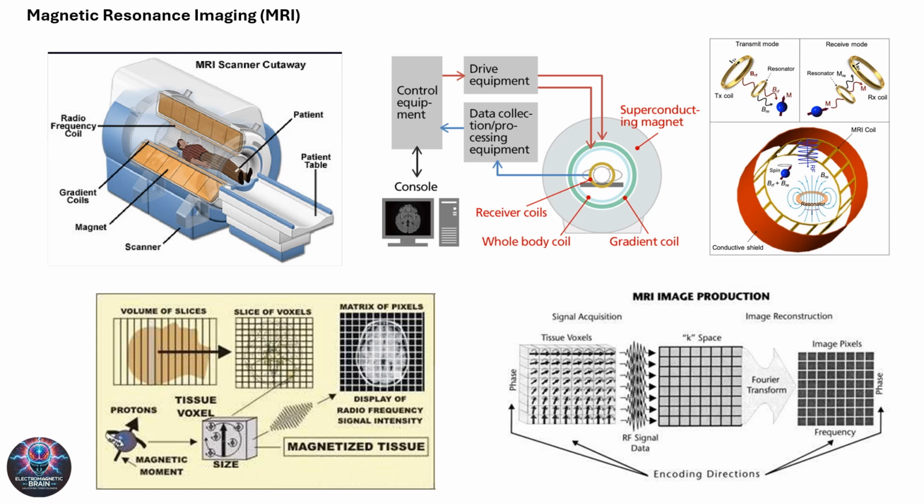MRI's ability to safely capture high-resolution images of delicate tissues, without ionizing radiation, is what makes it indispensable in fields like neurology, oncology, and pediatrics.